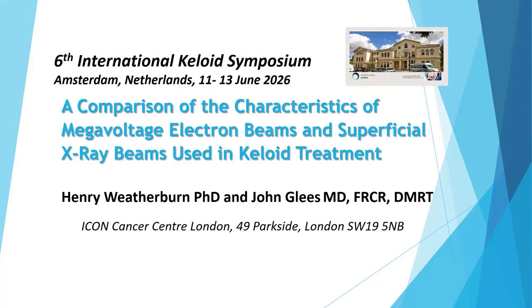I'm now going to talk about a comparison of the characteristics of megavoltage electron beams and superficial X-ray beams used in keloid treatments. At the 5th International Keloid Symposium, I presented a cost-effectiveness comparison of these two types of equipment. Both are employed for the treatment of keloids. The comparison I made then identified kV X-ray units as being more cost-effective and simpler to quickly set up for patient treatment.